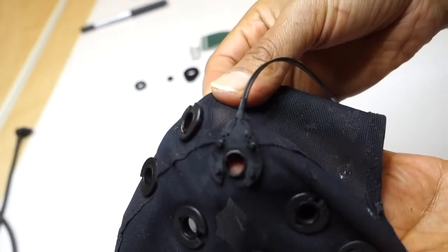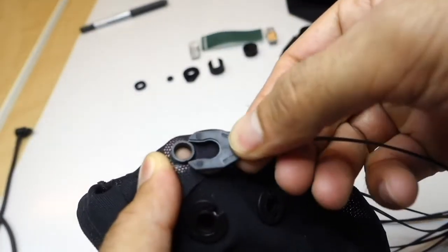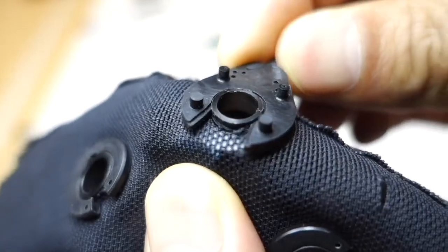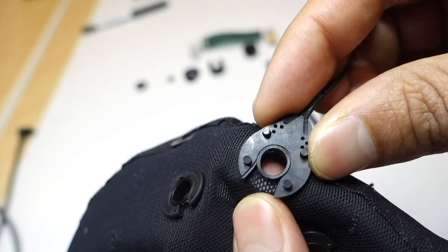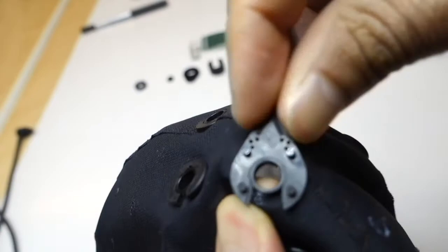It's important that the clip is engaged all the way and that it has not caught any fabric, as we see here. And if that happens, you could gently rotate the short detector. If a fiber is stuck, you see the base is slightly disoriented.